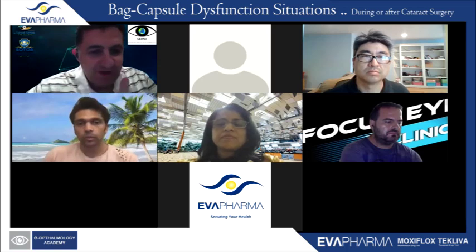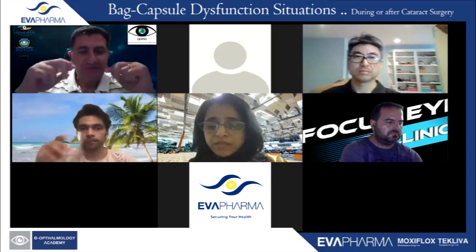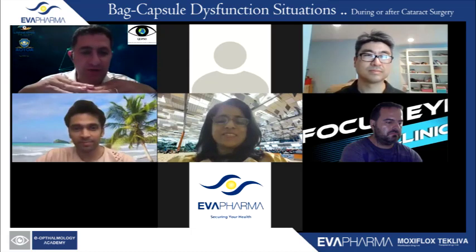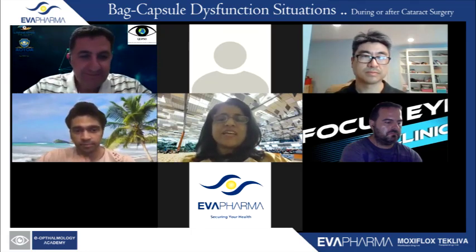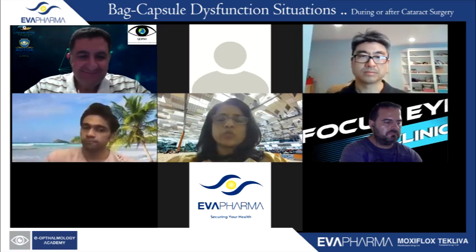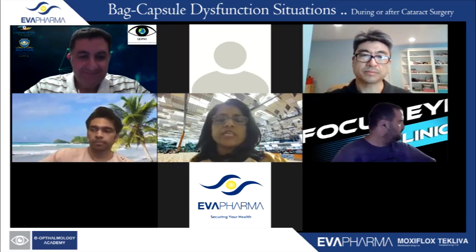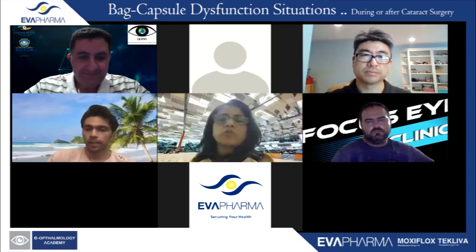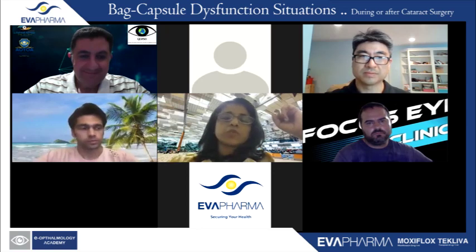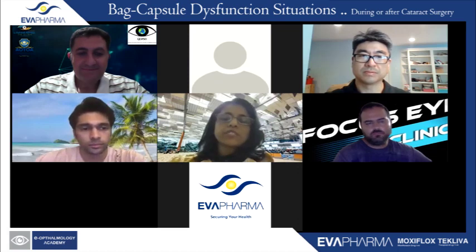Susan, I have one question for your technique, Supracapsular. You didn't try to use your paper clip for the bag to support the bag. Then you put your IOL Supracapsular. Yeah, Ashraf, actually, when you're looking at those cases, there are 3 things that you can do. One is you can do a lensectomy with a secondary IOL fixation of your choice. Second thing is that you can put 2 paperclip capsule stabilizers, which you can go on both sides, because we were talking about progressive subluxations there. If it is non-progressive, you can just put a paperclip and that's fine. Progressive subluxations, you would want to take care of the delayed subluxation, which can happen with time also.